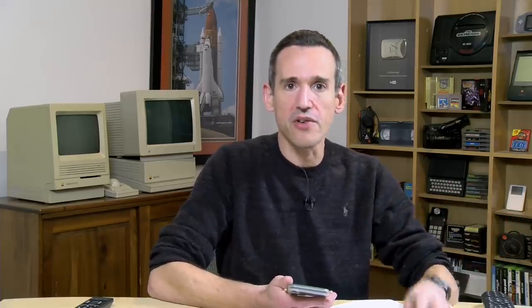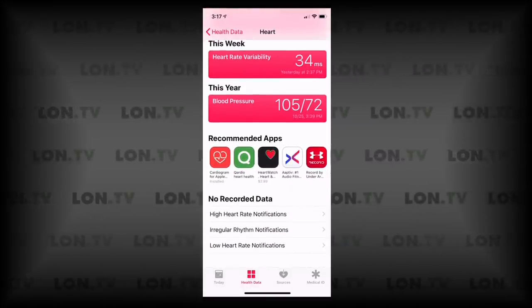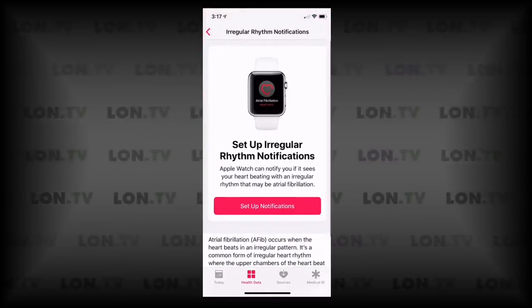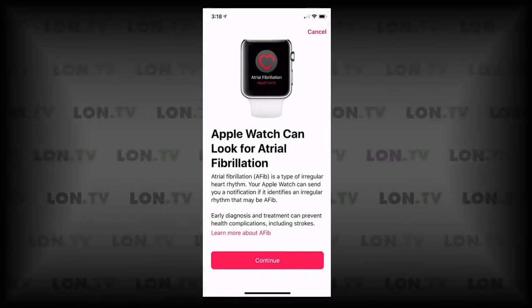This test does not run automatically — it only runs when you initiate it on the watch and hold your finger to the crown for 30 seconds. However, the heart rate sensor can also detect irregularities, though it won't be as accurate as the ECG. Nonetheless, if you are having an irregular heartbeat, you can then run the ECG or seek medical attention. Inside the Health app in the heart section, you'll see an option for irregular rhythm notifications — if you click setup notifications, it will send you a warning when the heart rate sensor notices something out of whack.